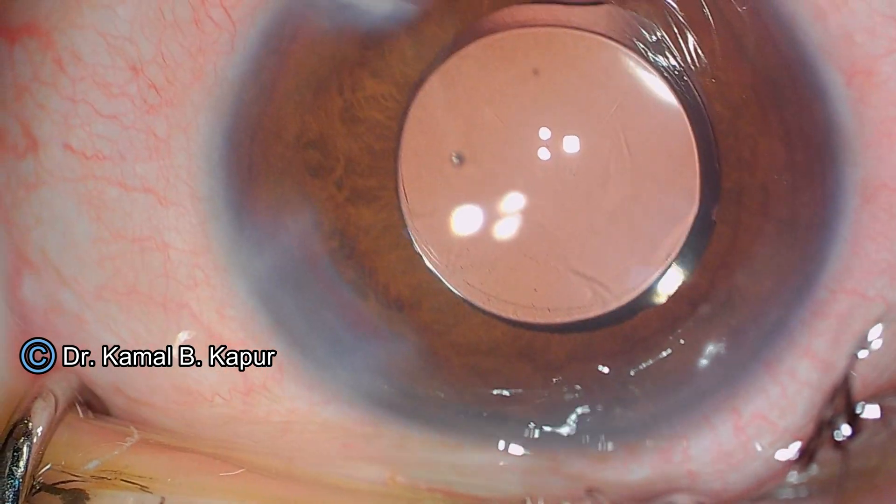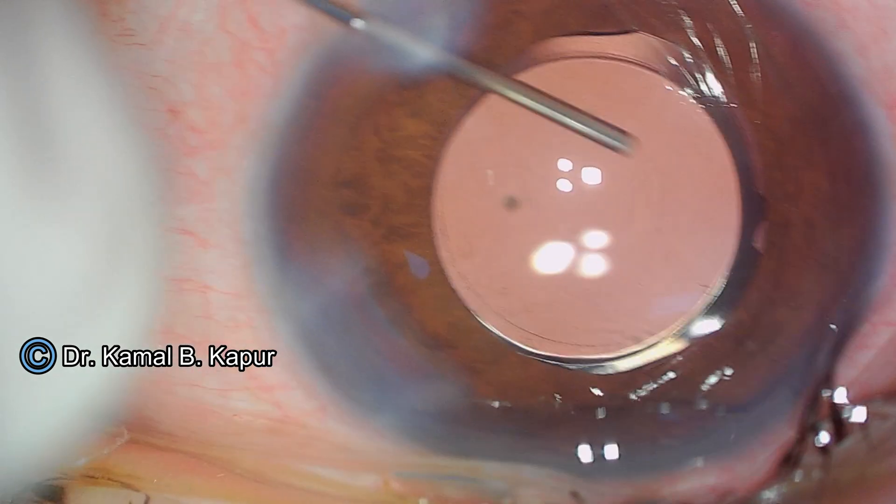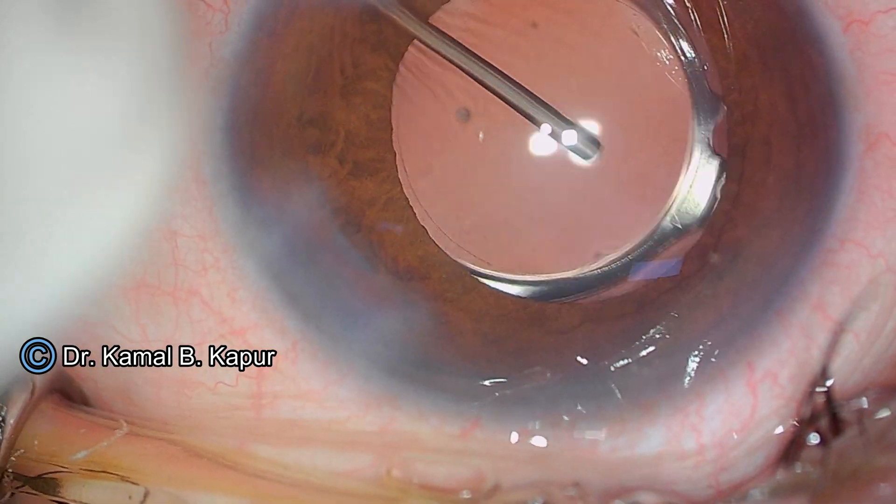You can see it is a pristine, clear, shining anterior surface of the lens, and we have had very good experience with this particular lens in our patients. Thank you.